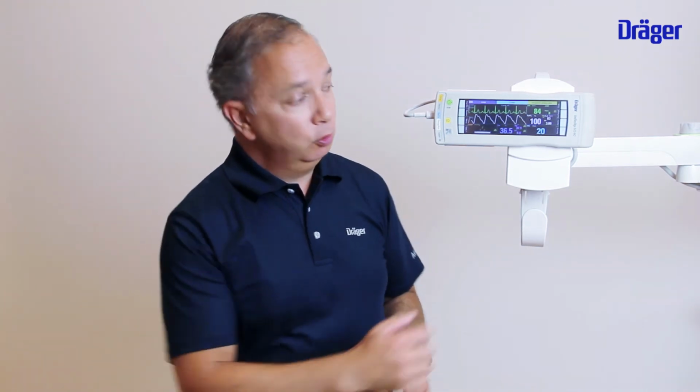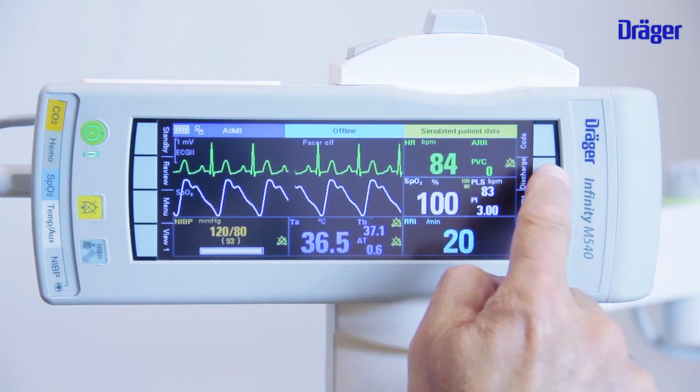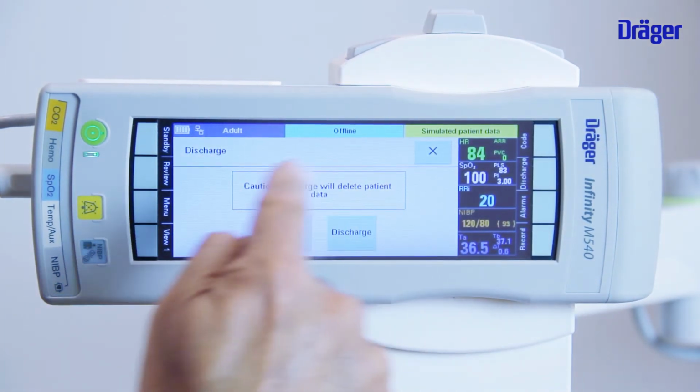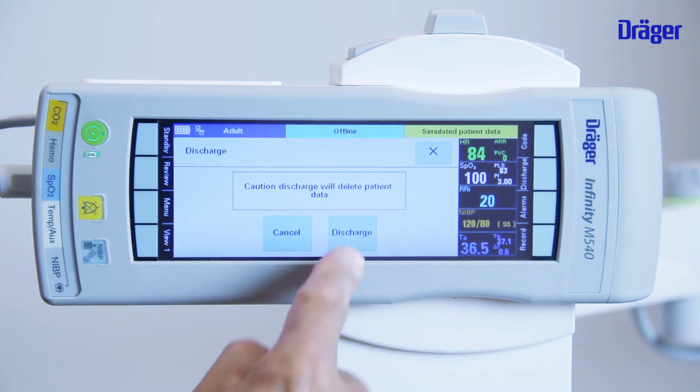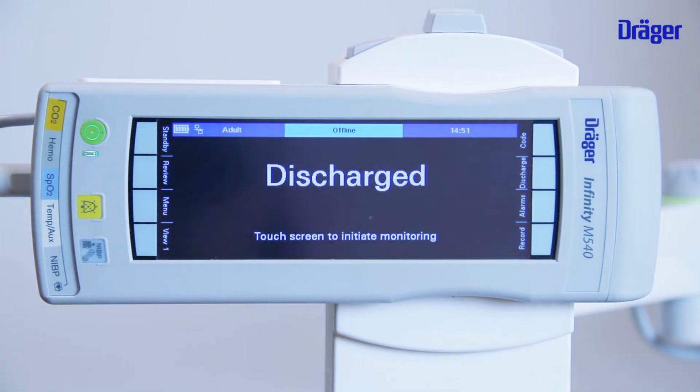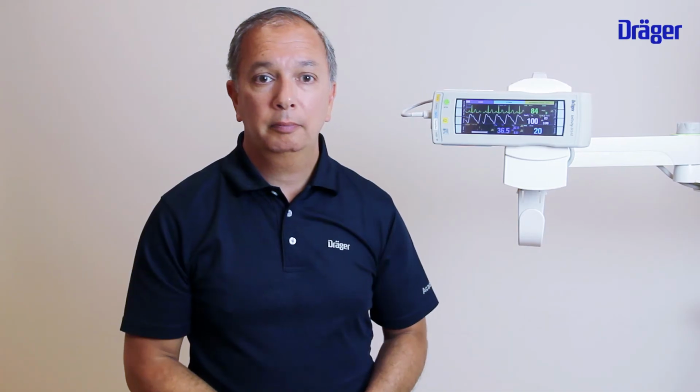You can use the discharge key to discharge your patient from the patient monitor. You can use this key over here, and when you press it, you always have to confirm it for the second time just to make sure that you want to discharge your patient. Once you have discharged your patient, all patient data will be deleted from the M540 standalone.